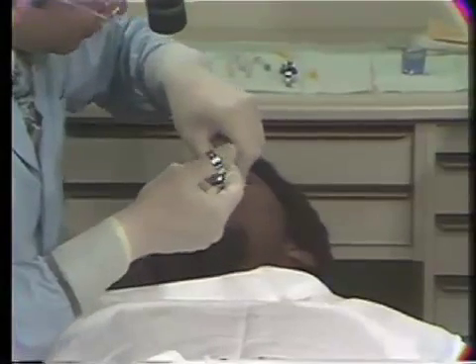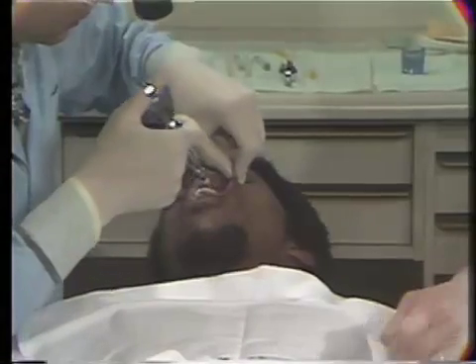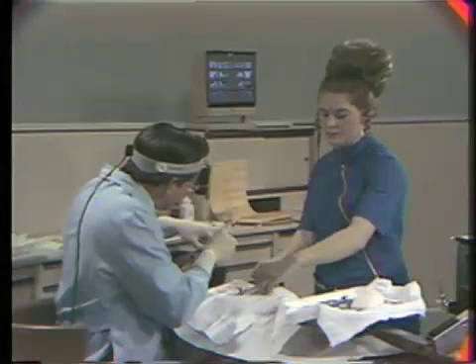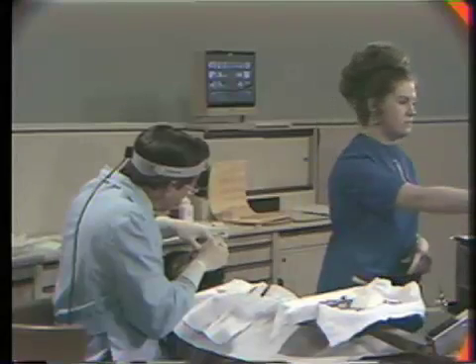As we know, one of the most important aspects of assisting is anticipation. And this is why an experienced assistant is so valuable, because she knows as well as you do what's coming next and has everything waiting and available for me.